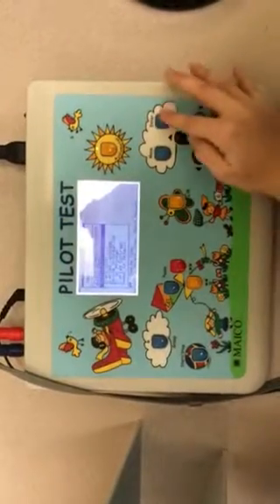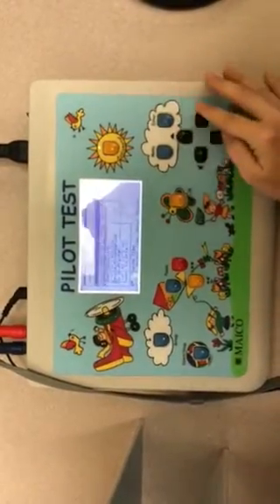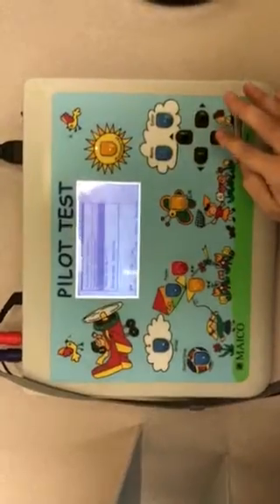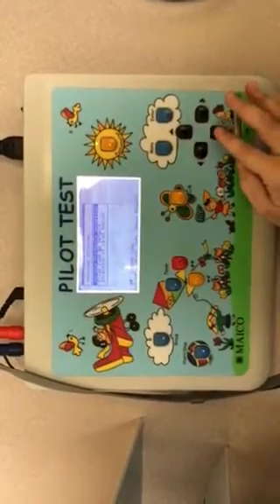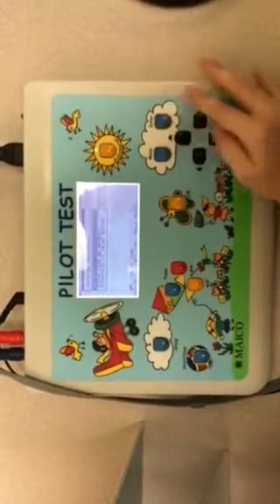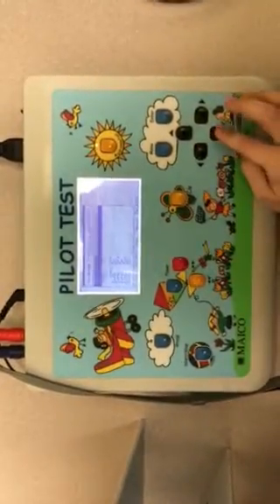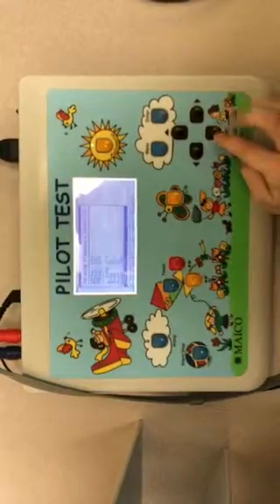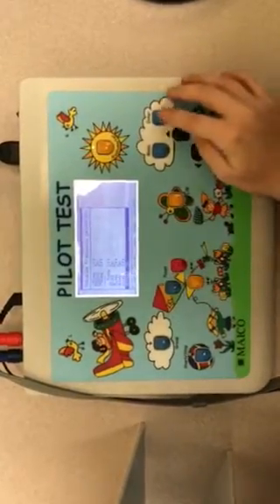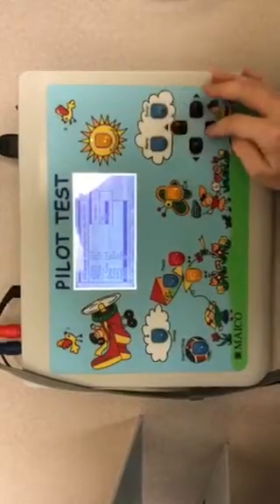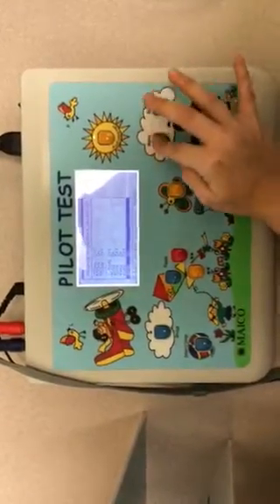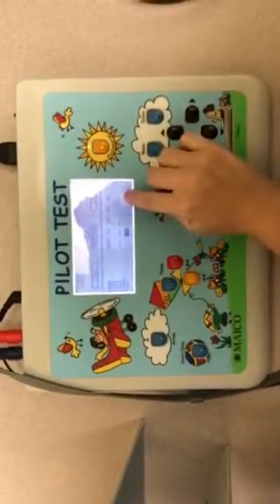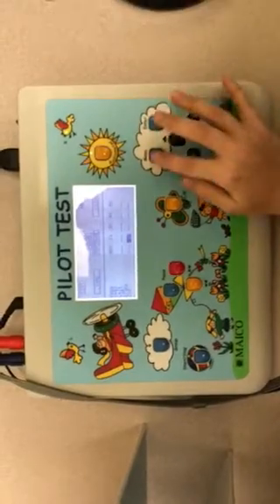Go to menu, audio, advanced settings, then advanced frequency selection. Make sure the 8000 is turned on — hit enter to toggle it on or off. You want to make sure it turns on, then press menu again and the 8000 shows up here.